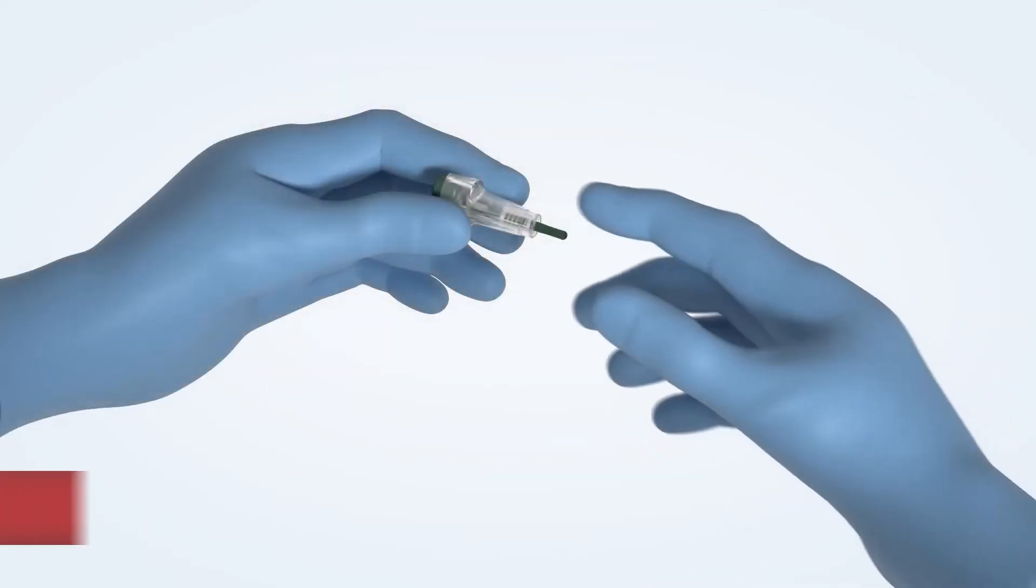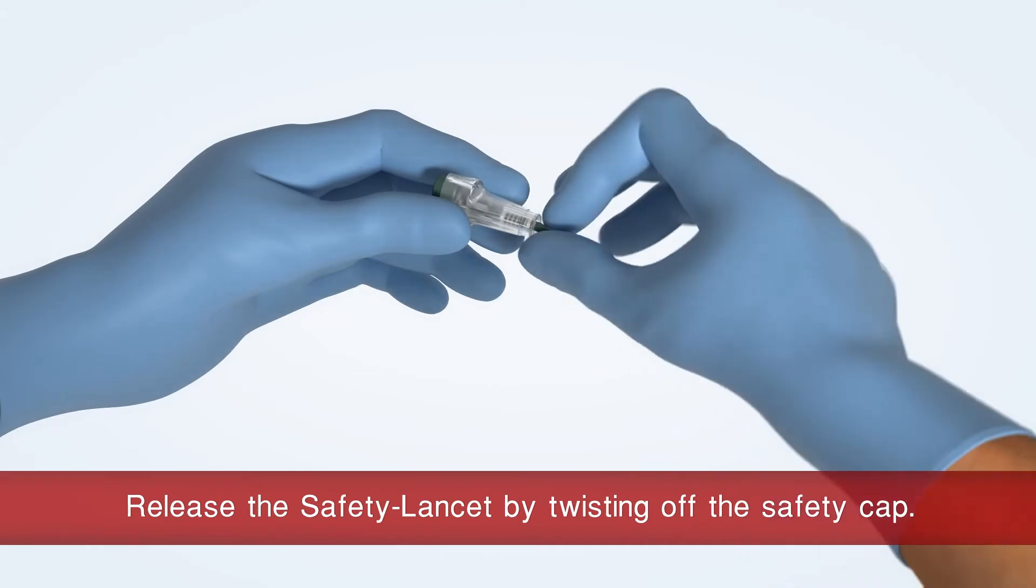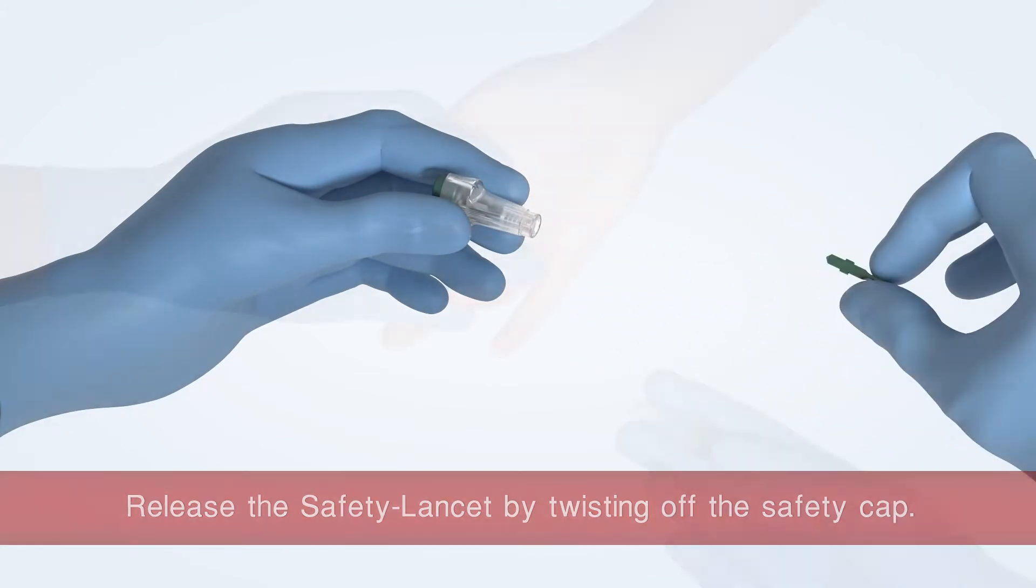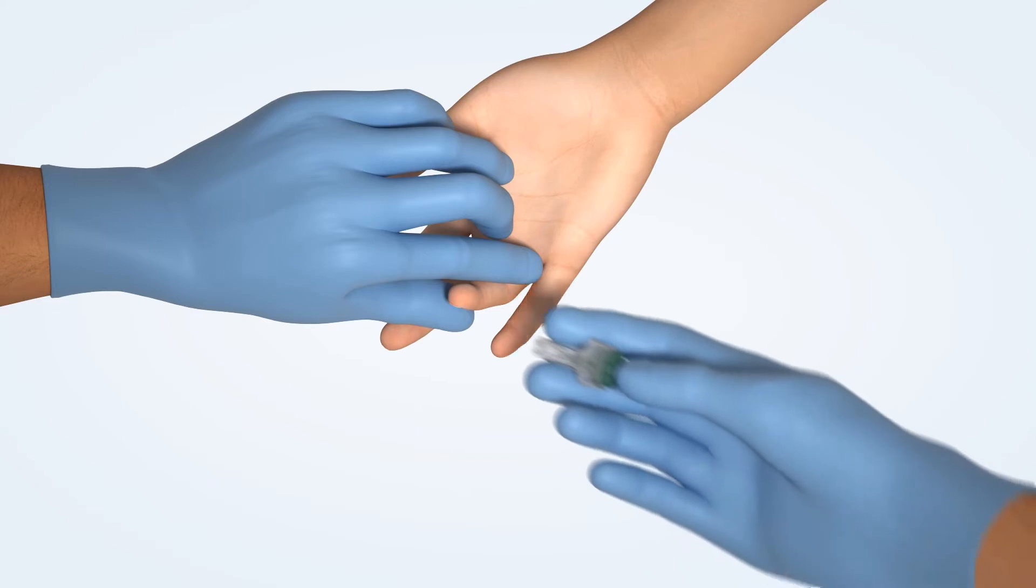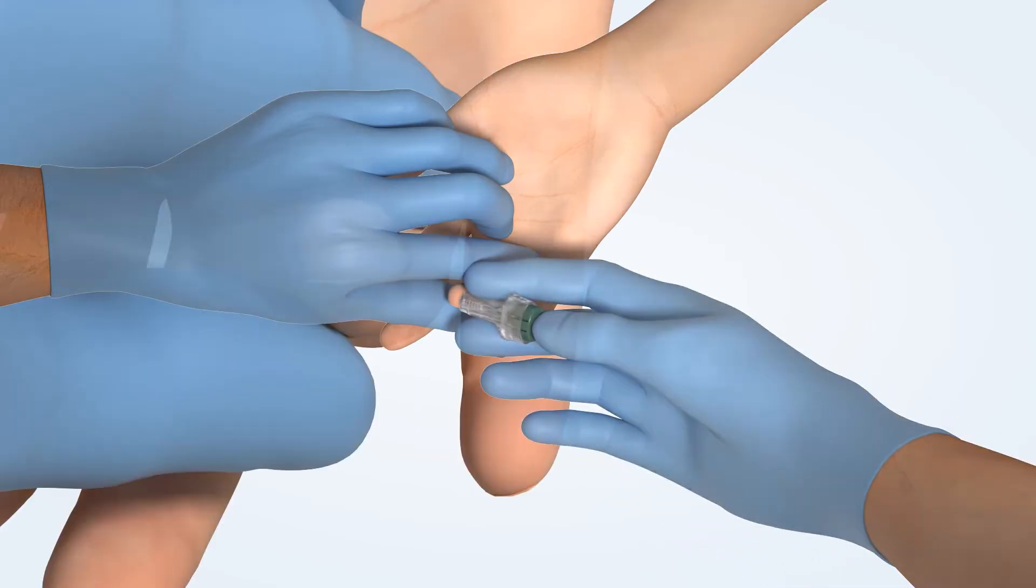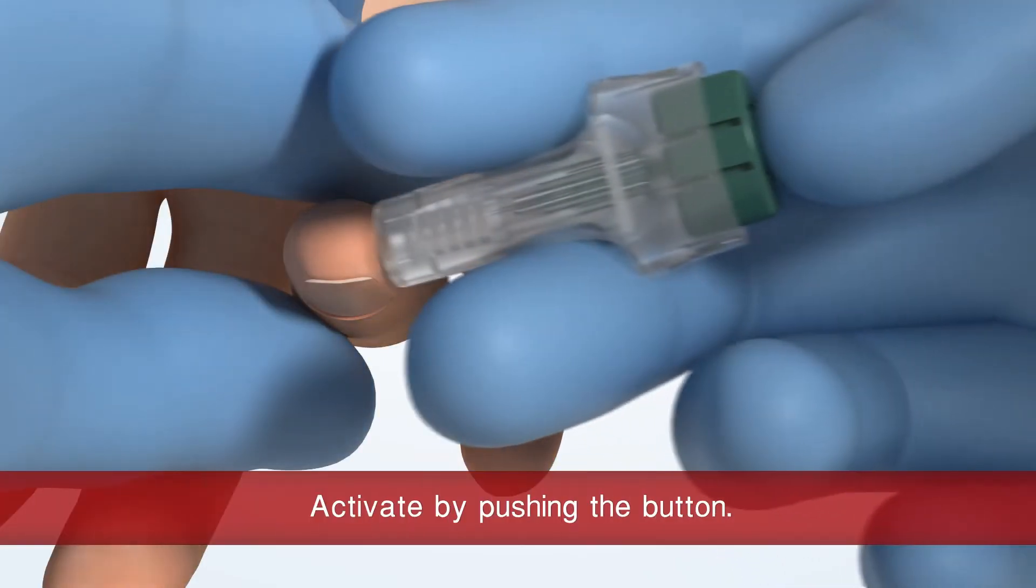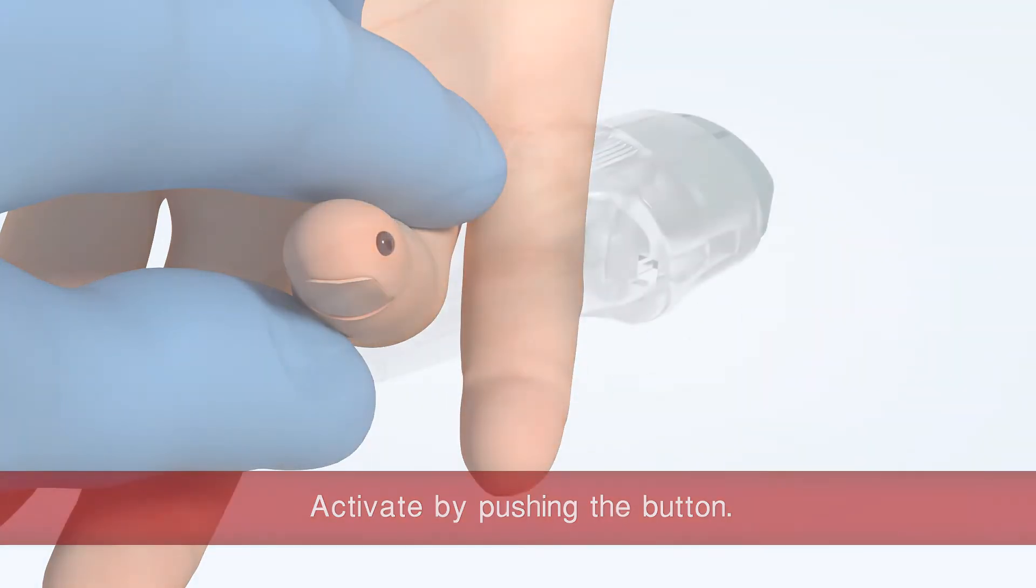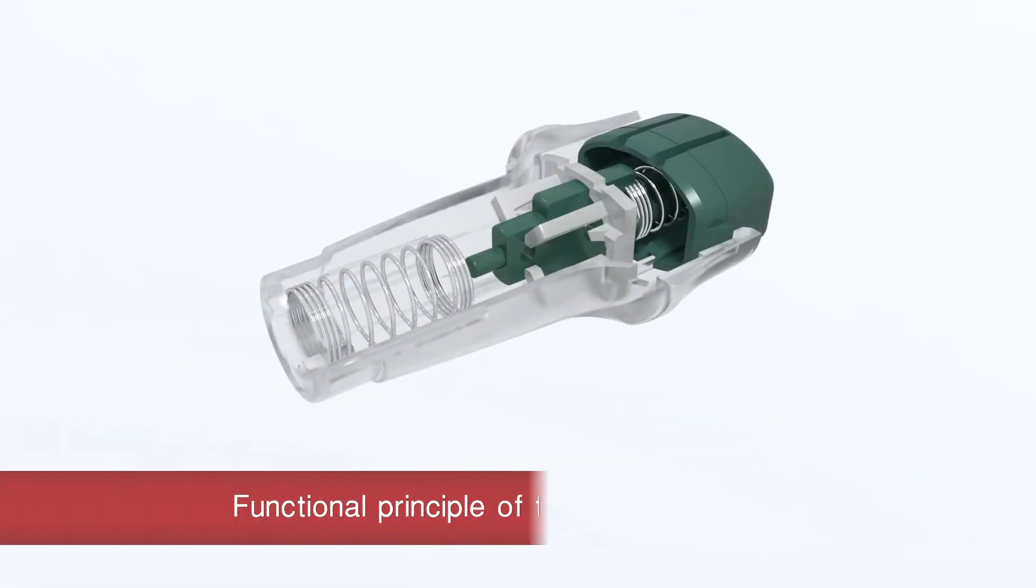Take the safety lancet and twist off the safety cap. Place the safety lancet on the suitable puncture site and activate it by pushing the button. Please see the functional principle of the safety lancet.